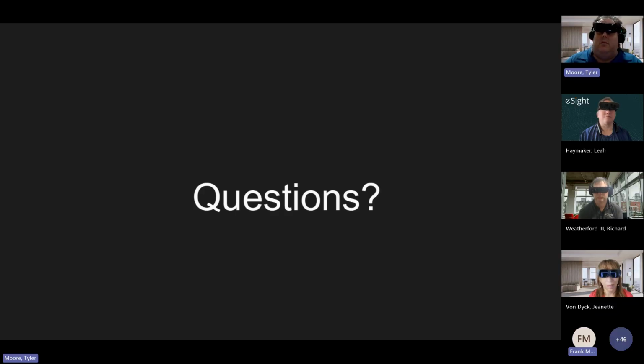And this newest version is version 5.03. No, it's 5. The software is 5.2. Okay, so I'm still 5.03, so I got to get this to update, because I don't have that exposure option, and I can't figure out how to get it to update. Right. So you want to make sure you're connected to Wi-Fi, and then to restart the device. And it might take a couple of restarts in order to have the unit registered if there's an update available with the unit.